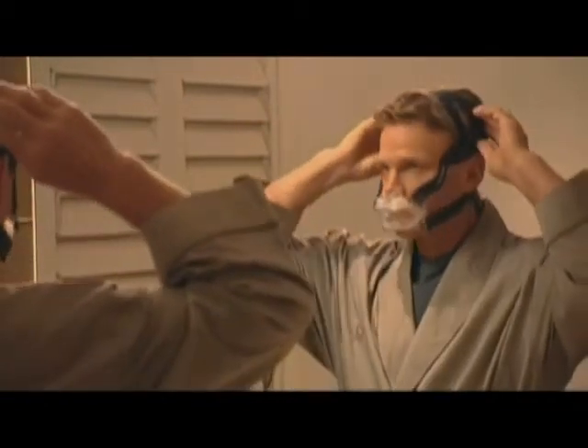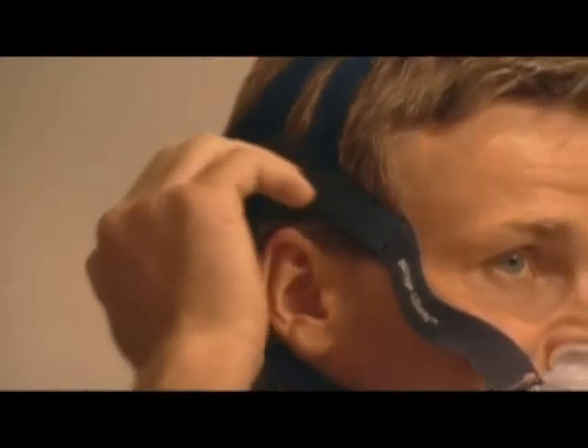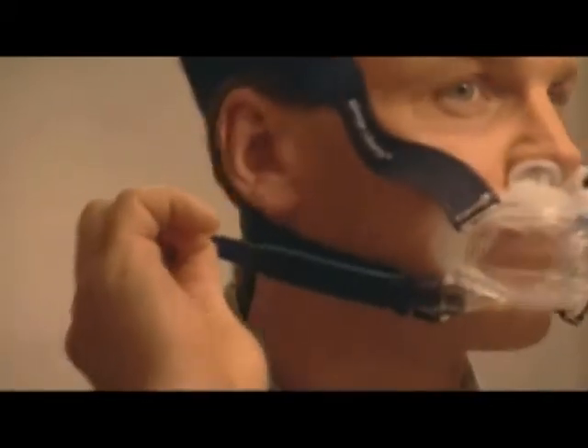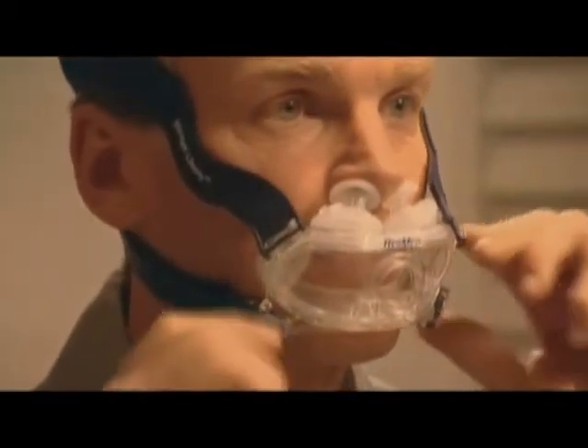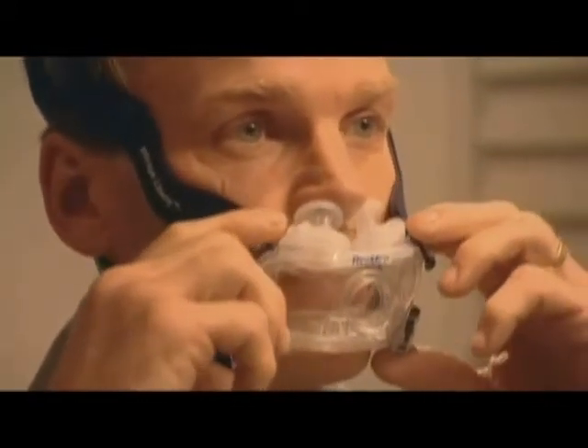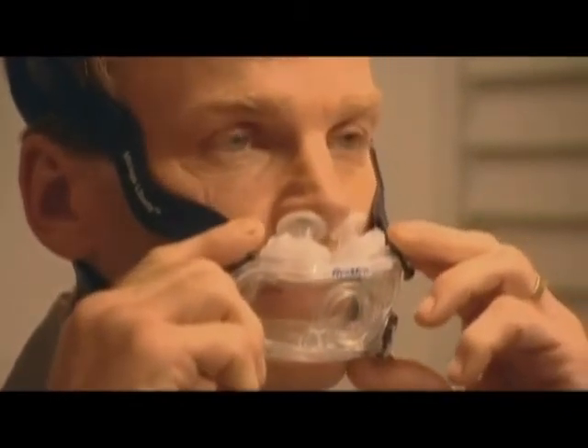Next, gently tighten the headgear straps, first the top and then the bottom, so that the sides of the headgear rest between your eyes and ears. Do not over tighten the straps. The mask should gently float on your face. Over tightening your headgear can lead to mask leaks.